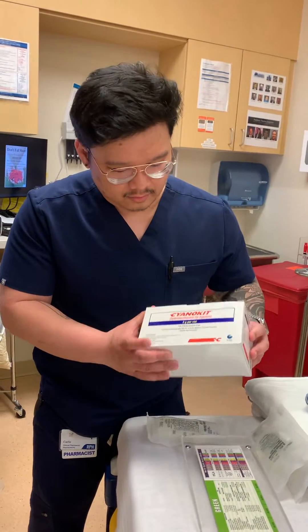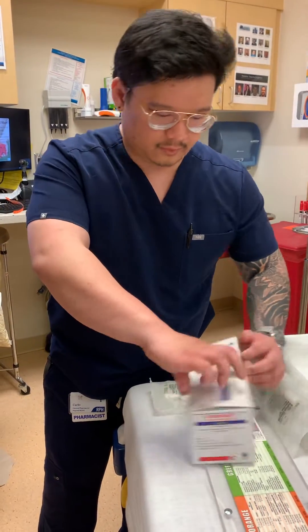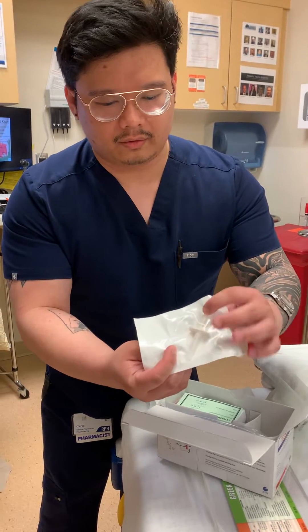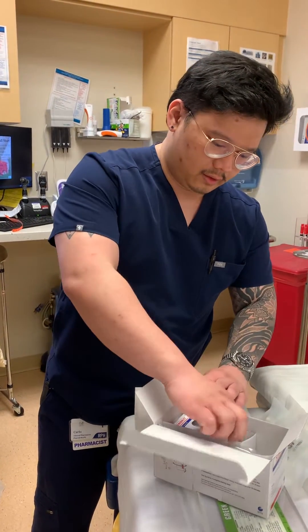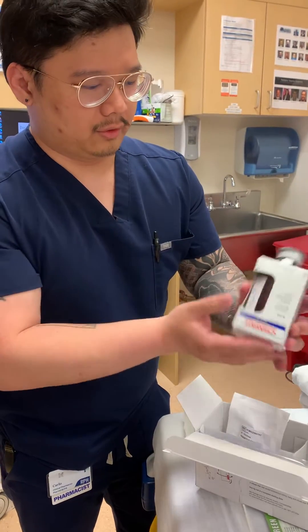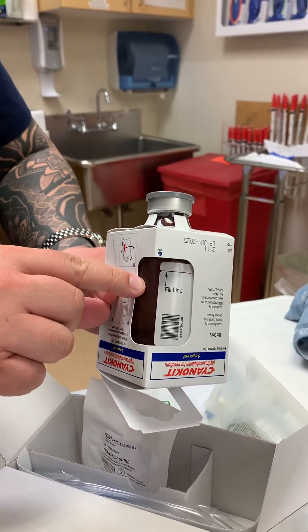Your Cyanokit is pulled from stock in your main, and it comes in this kit. It should come with a two-ended spike. Your bottle will actually be in this smaller box so that you can hang it afterward. When you go to mix it, you'll want to rotate it until you can see where the fill line is.